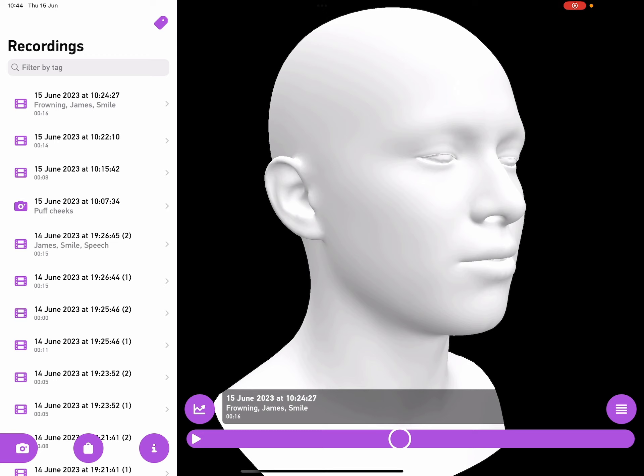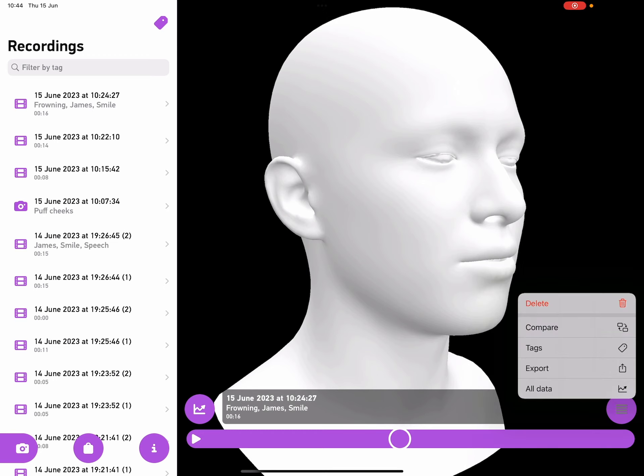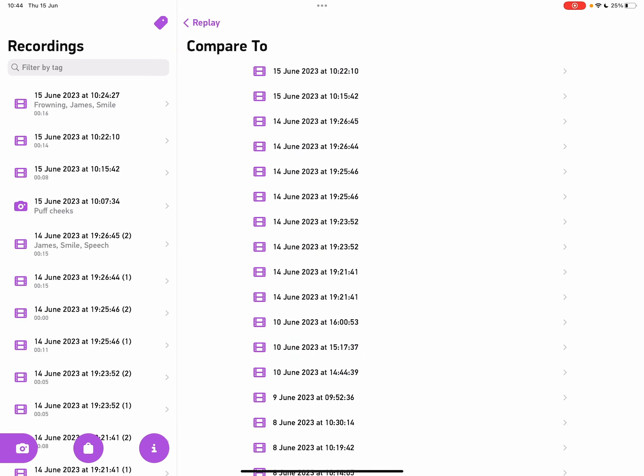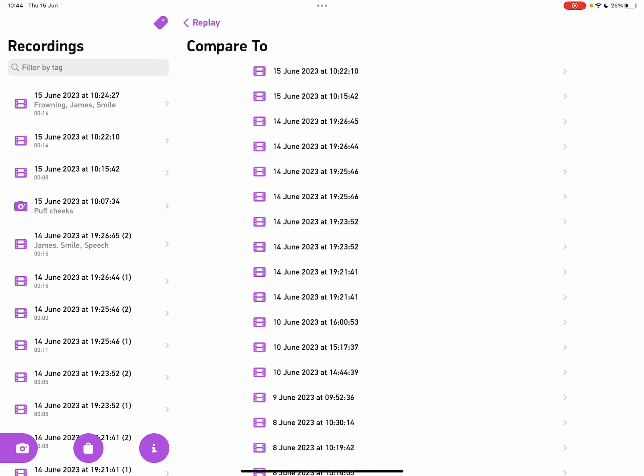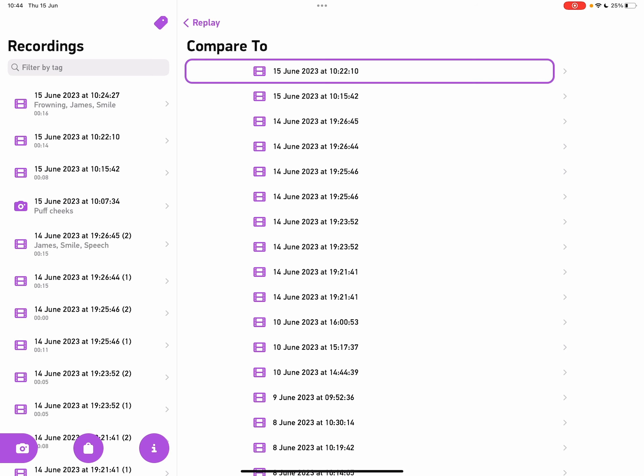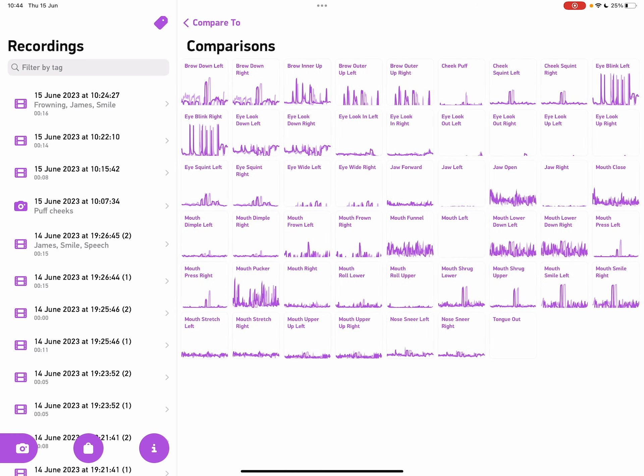Tap on the menu again, and now I can tap compare. This brings up all the other recordings, and if I select one, what I'm seeing now are graphs comparing this recording to the other. So if this was the same exercise, it would allow me to see any progress.